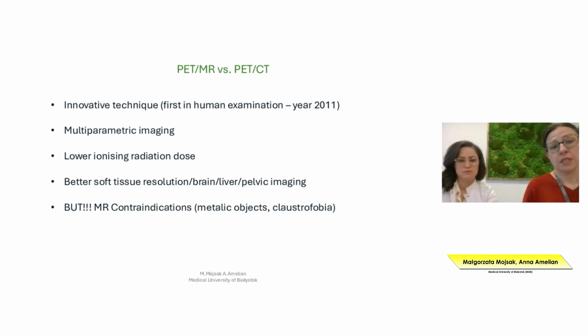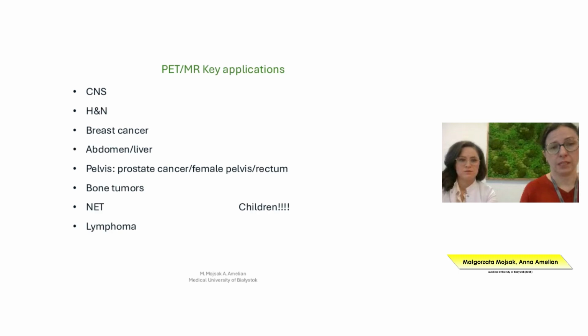So PET-MR technology differs from PET-CT, but there are different applications.